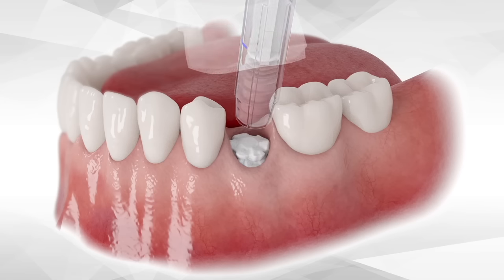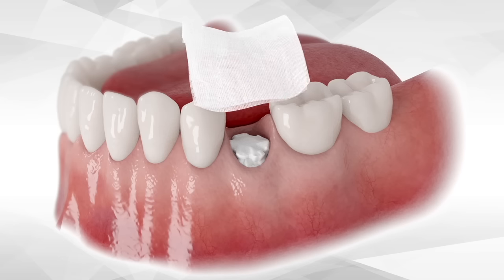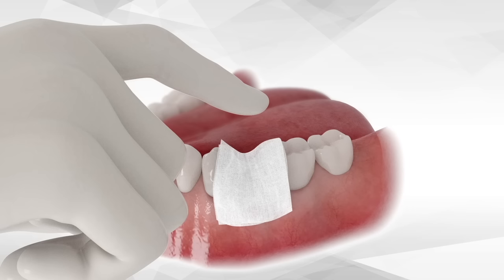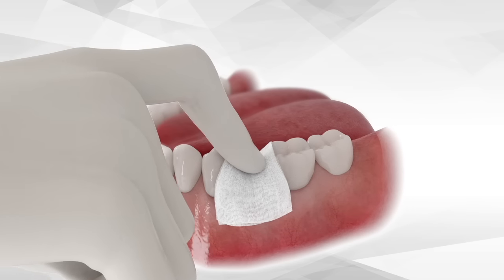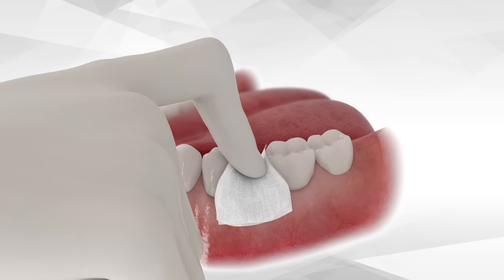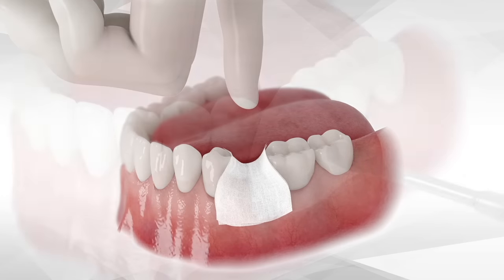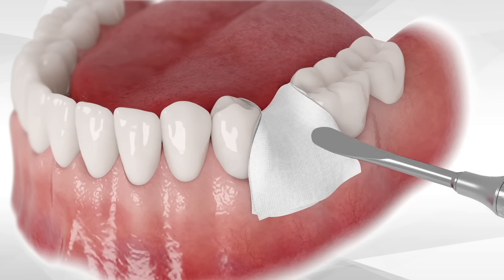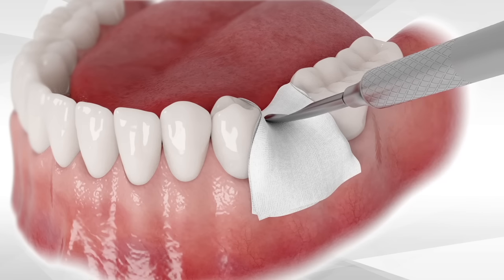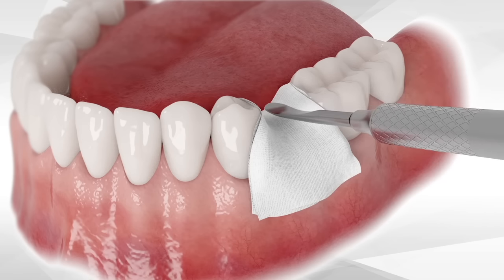Immediately, a sterile unfolded dry gauze is placed over the cement and pressed firmly with the finger from the crestal direction for about three seconds. It is extremely important that the Bond Apatite cement will be well compacted. Thus, after pressing with a finger, use the periosteal elevator in order to continue with the compaction of the graft for an additional few seconds, again from the crestal direction.